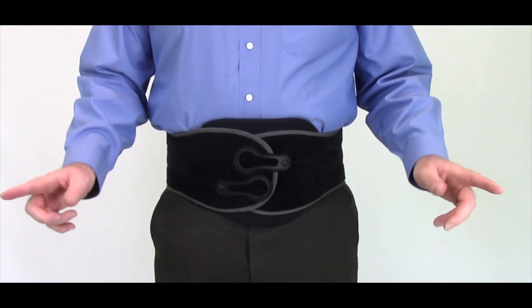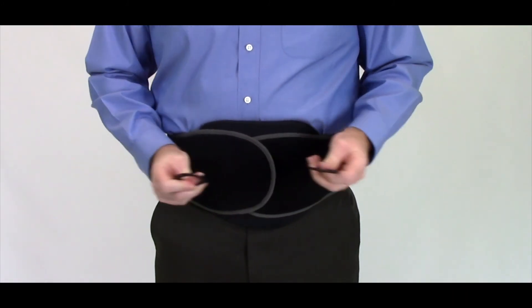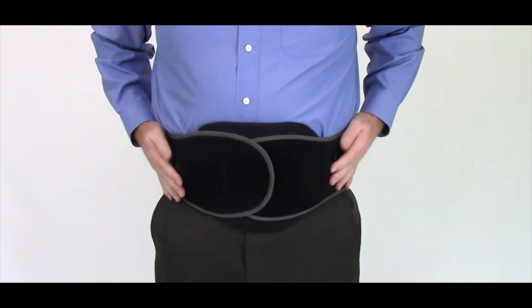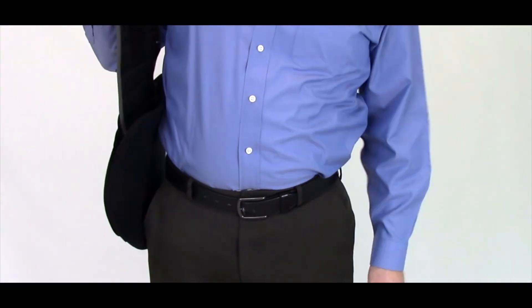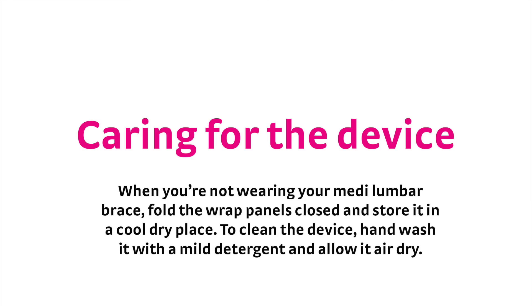To remove the device, first loosen the O-ring cinch straps by pulling them away from the wrap panels, and reattach them towards the back of the device to keep them out of the way. Then, pull the right side wrap panel away from the left and pull the device off.